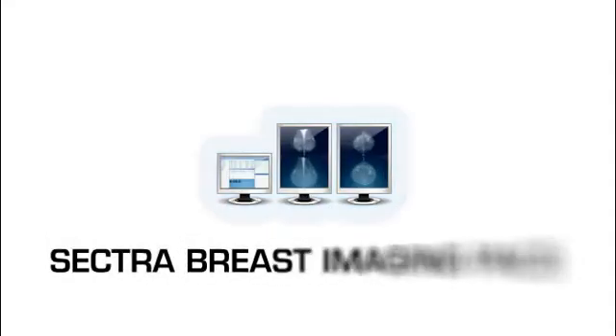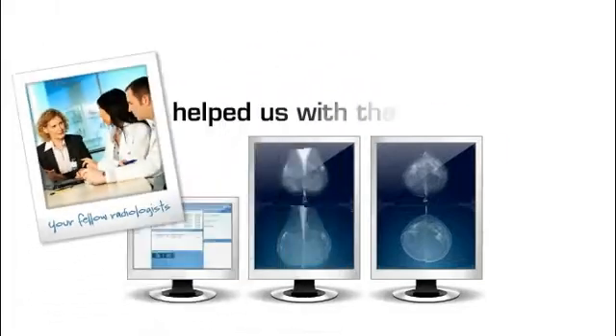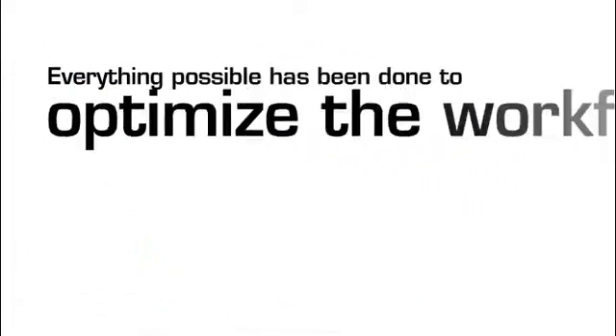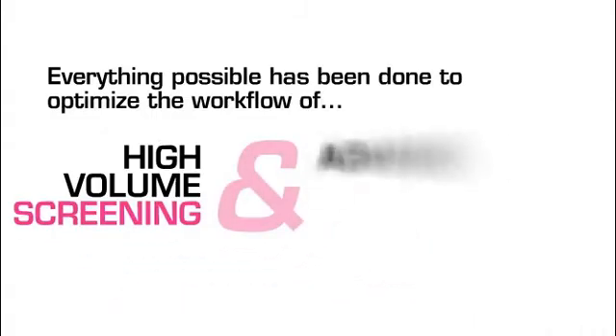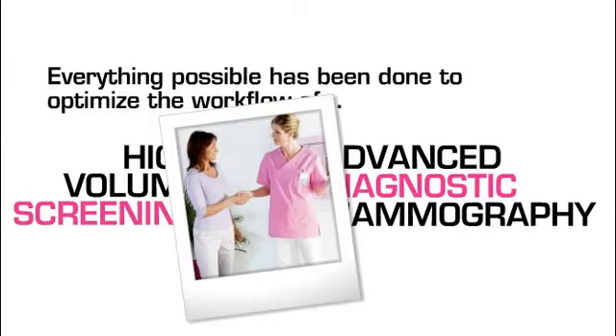This is Sectra Breast Imaging PACS. We hope you'll like it. Your fellow radiologists helped us with the design. Everything possible has been done to optimize the workflow of high-volume screening and advanced diagnostic mammography, with a clear focus on patient care.